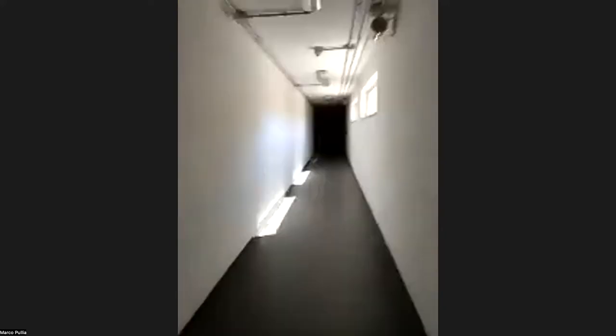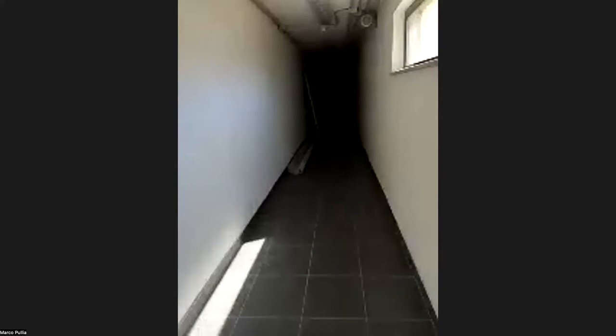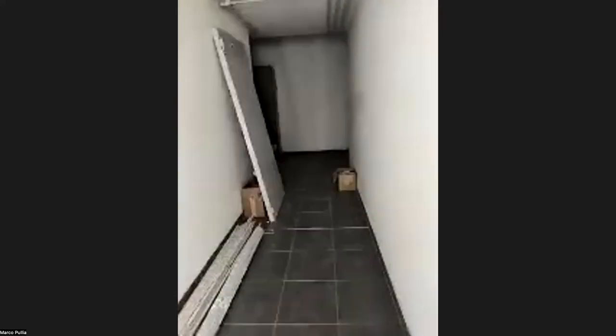Not everything is next to each other right now. I hope you still see me. Yes, we do, Marco. Very good. Now into the dark. Almost. And here we go to the experimental room.